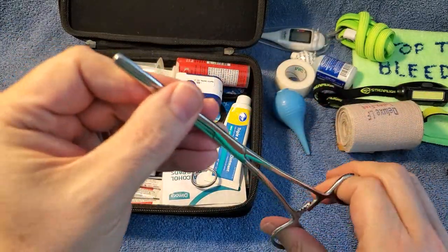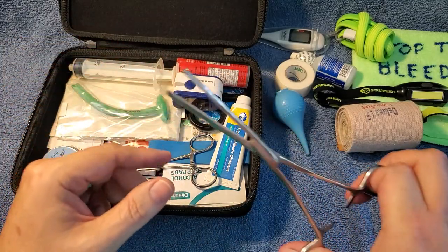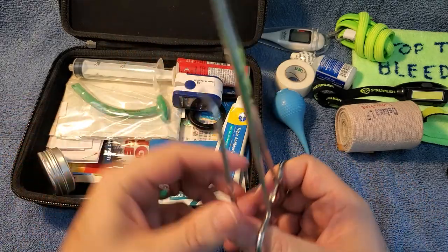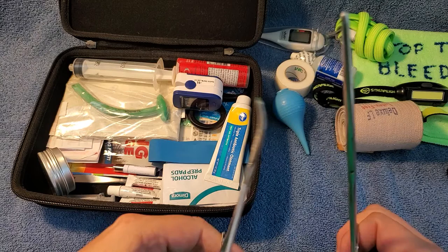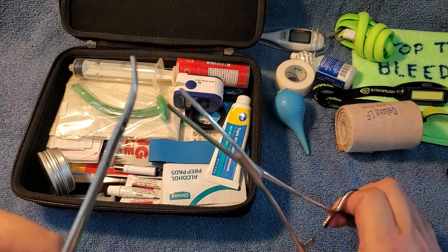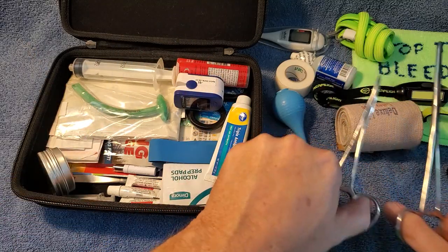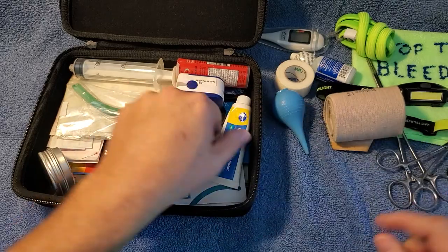Hemostats. These are big ones — good for a deep cut or an artery. If you can reach in there and see that artery and clamp it off, you just saved your life. I've got a second one here too as a backup, because sometimes you might need one to pull the skin back so you can get in there and find that squirting artery, clamp it off. That's what they did in the war — that's how most people got their life saved.